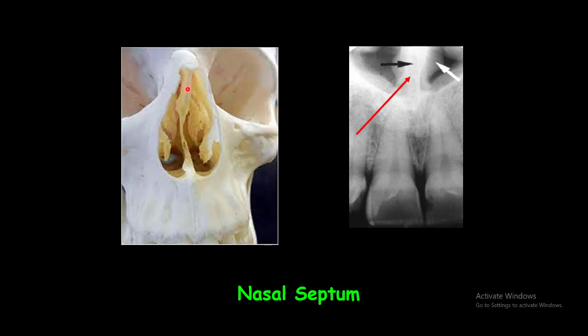The nasal septum is seen in the midline. In the periapical radiograph of the maxillary incisors, the nasal septum is radiopaque because of its bony composition. The shadow of the septum may appear wider because of the superimposition of the nasal cartilage.